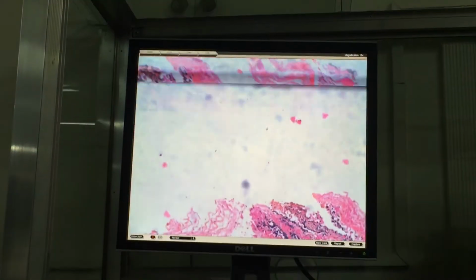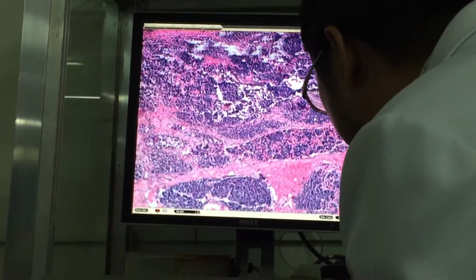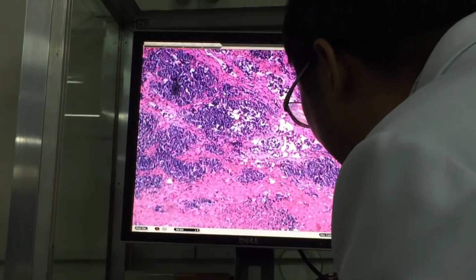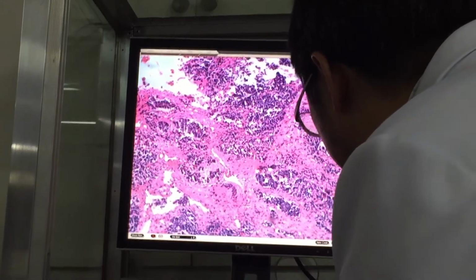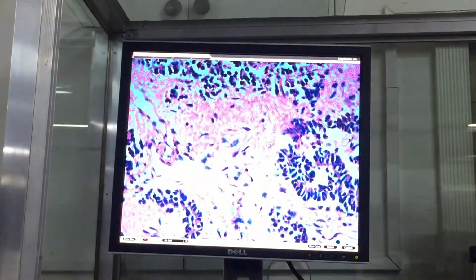The epithelial cell. Sana. If I don't show it, I'm dead. Anyway, tingnan nyo na lang sa libro niyo. Ay, I found it. Yes, this one.